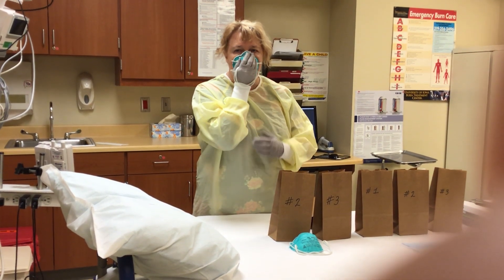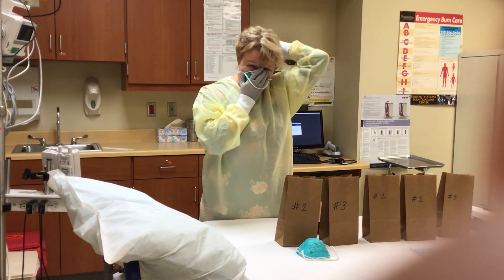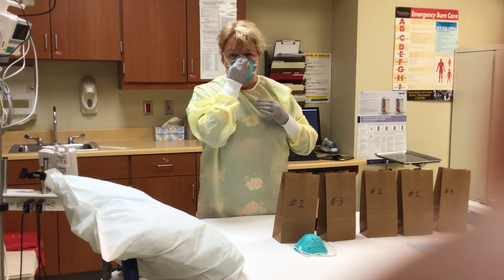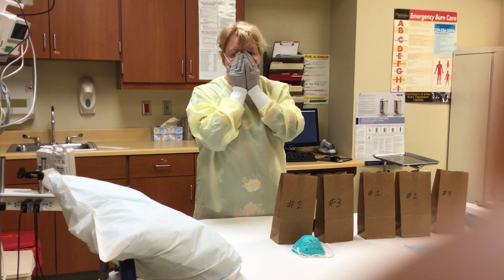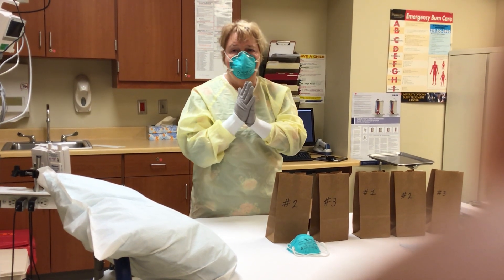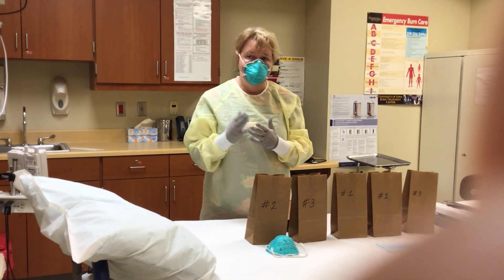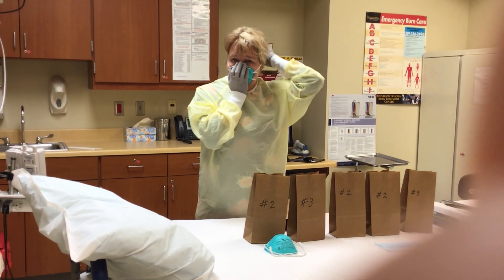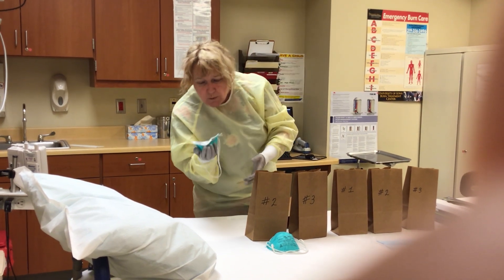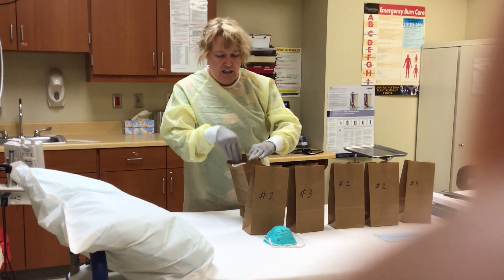Very carefully, take the mask and put it up against your face. You're going to take your bottom loop and pull it up over your head, then the top loop. Make sure that it is nice and tight. Do a quick check — put your hands over your mask and breathe in. If the mask kind of collapses down against your face, you have a good seal. For taking the N95 off, put clean gloves on, grab the outside of the mask, take the bottom loop off and then the top, being very careful not to touch the inside of your mask. Then put that mask in the paper bag.